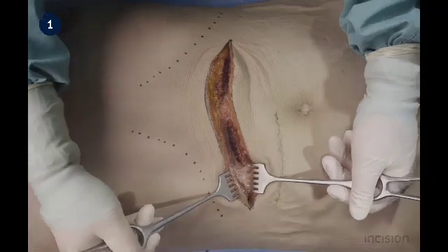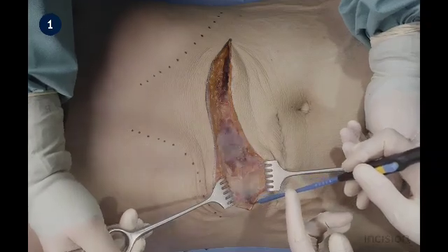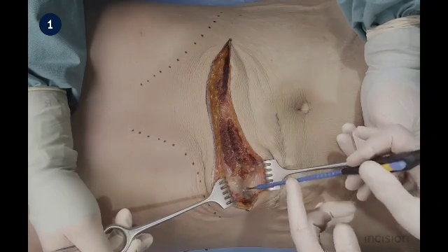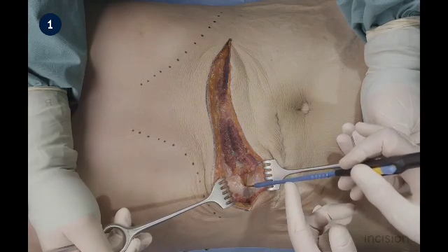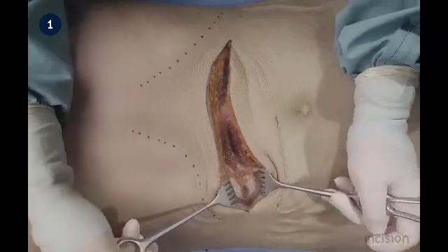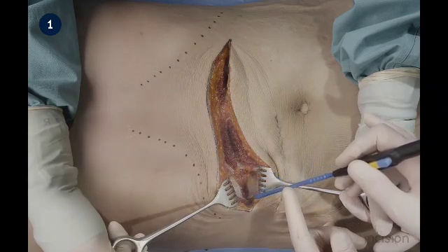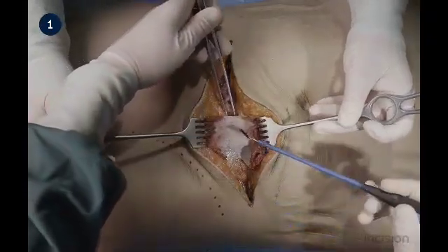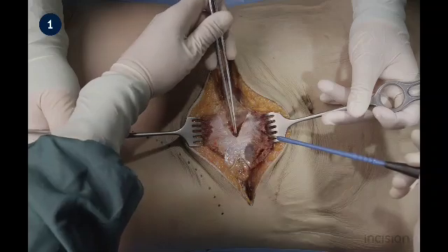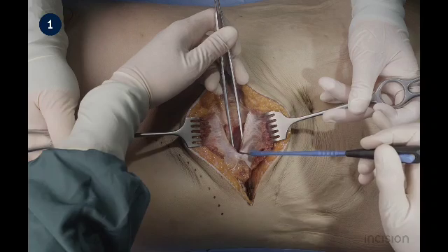The other muscle layers, consisting of the internal oblique and transverse abdominal muscle, are dissected here. The posterior rectus sheath should be incised. Take care not to damage the posterior bowel by lifting the posterior rectus sheath and peritoneum with forceps. The posterior rectus sheath and the peritoneum can be confluent, as shown here, and are cut simultaneously.